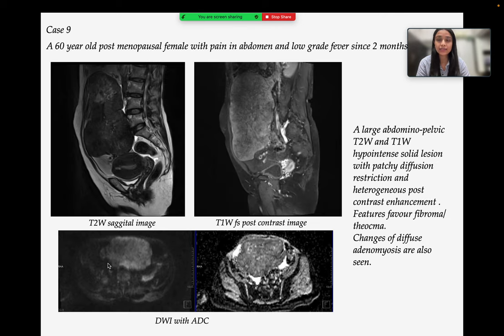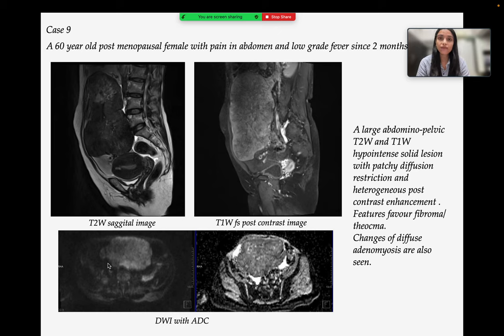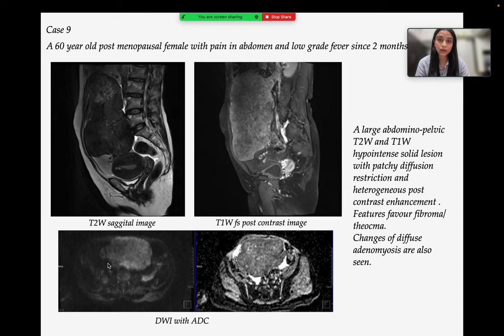Case 9 is a 60-year-old post-menopausal female with pain in abdomen and low-grade fever since 2 months. Images show a large abdominopelvic T2 and T1-weighted hypointense solid lesion with patchy areas of diffusion restriction and contrast enhancement. Features favor fibroma-thecoma. Changes of diffuse adenomyosis are also seen.